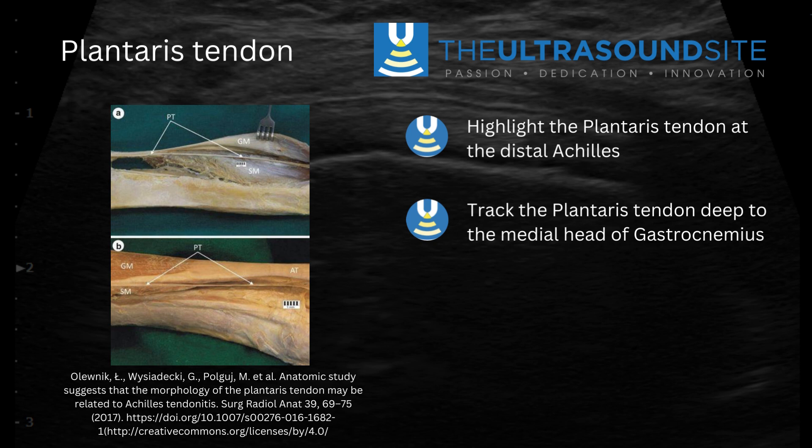It sits in a plane between the soleus and the medial head of gastroc muscle belly. We're going to have a look at it in long axis and then follow it back down distally to where it sits adjacent to the achilles.